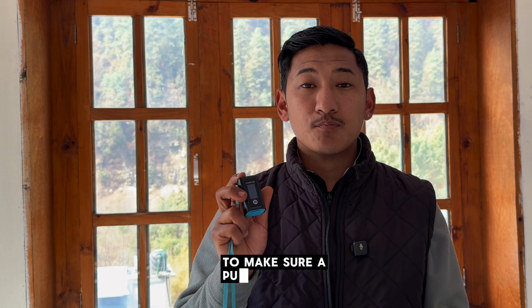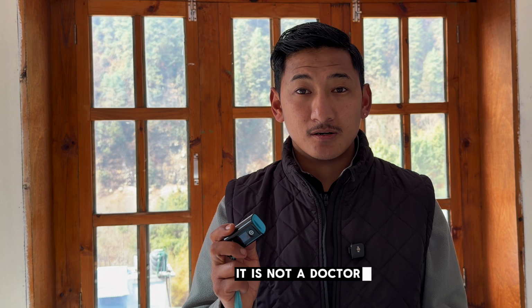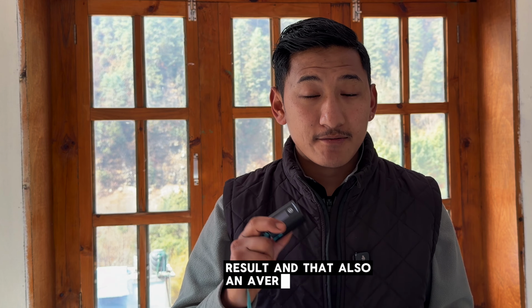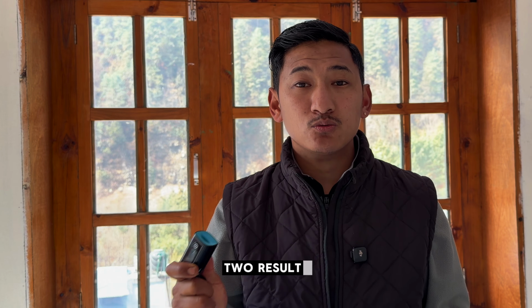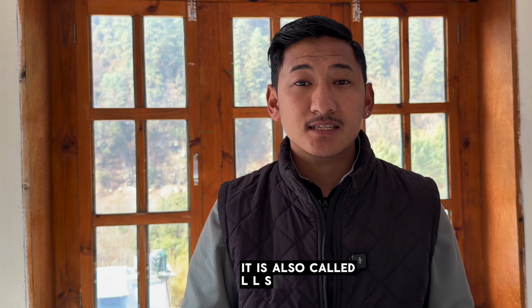To make sure, a pulse oximeter is just a diagnostic aid. It is not a doctor. You should always compare your SpO₂ result, and that also an averaged SpO₂ result, with the Lake Louise system. It is also called the LLS system.